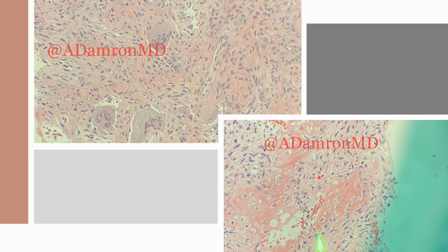One of the things to keep in mind if you have a malignant phyllodes tumor are these osteoclast-like giant cells. If you start seeing these osteoclast-like giant cells in a malignant phyllodes tumor, keep an eye out for malignant bone heterologous differentiation, because these often go hand in hand.